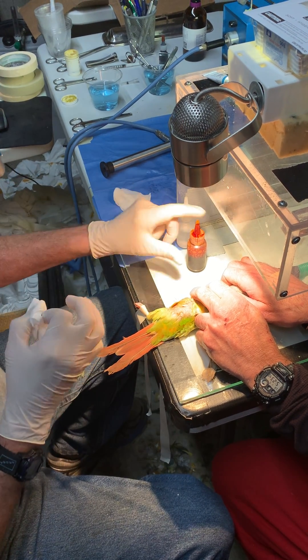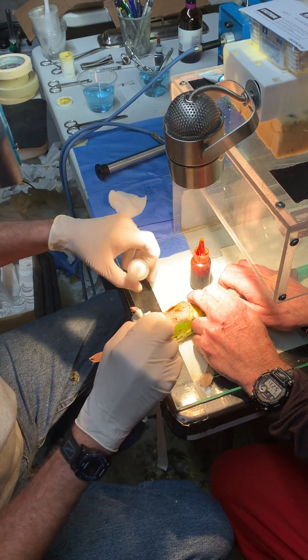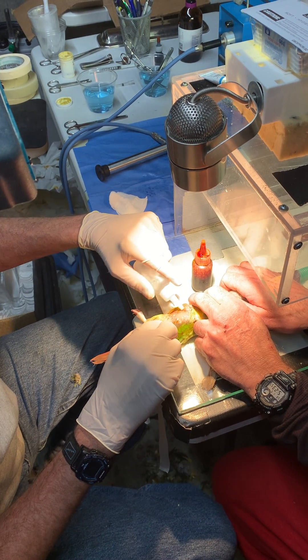Applying betadine. Just basically pluck a small area and clean it with betadine and alcohol.